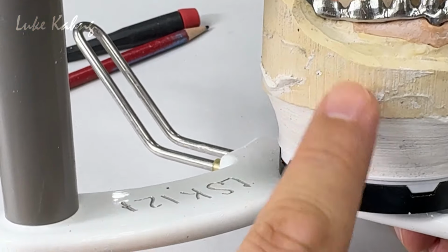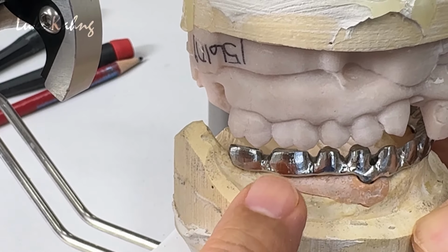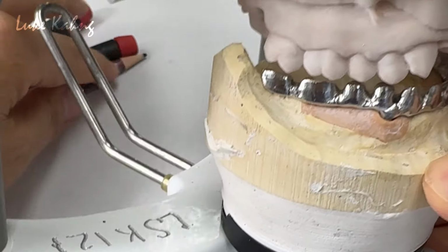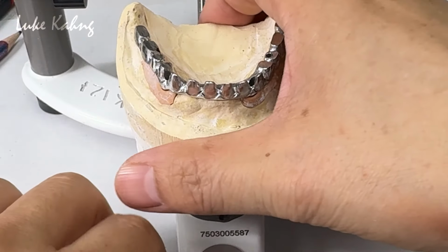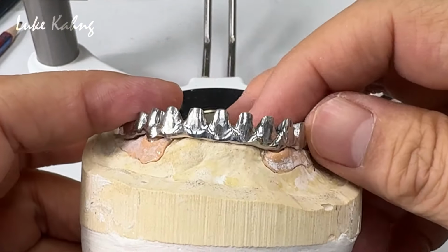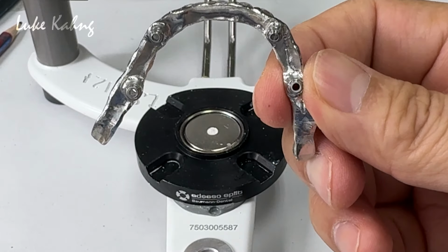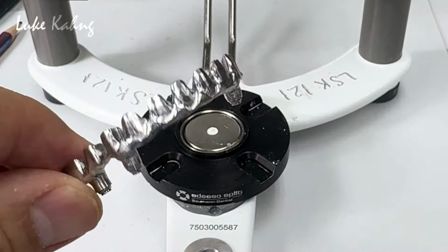So this one too. Because what we can do here is extend this halfway so we can block the super erupted teeth. That's my idea, but sometimes the doctor and I have to talk to the patients, so many things. Anyway, this is the try-in now with wax, I mean opaque, and then we scan and we design again. This is another great case though.